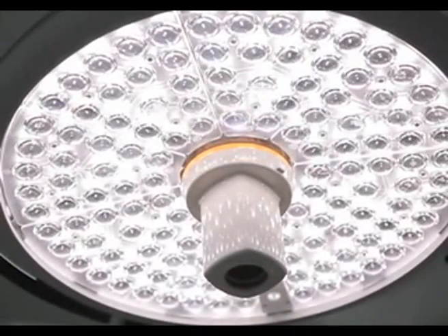In the early days, we used small mobile C-arms. They were analog, they had small generators, they tended to overheat, and they were not integrated with the operating table. The next step in the development was to take fixed systems into the operating theatre environment. These are either fixed on the floor or suspended from the ceiling with large rails. These rails interfere to a degree with the operating lights, and they interfere with the sterility because dust can collect on them and they could therefore contaminate the wounds.